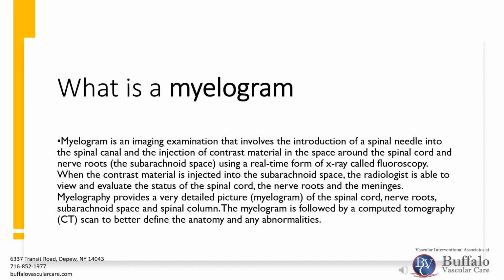It provides a very detailed picture of the spinal cord, nerve roots, and subarachnoid space and spinal column. The myelogram is followed by a CT scan to better define the anatomy and any abnormalities.